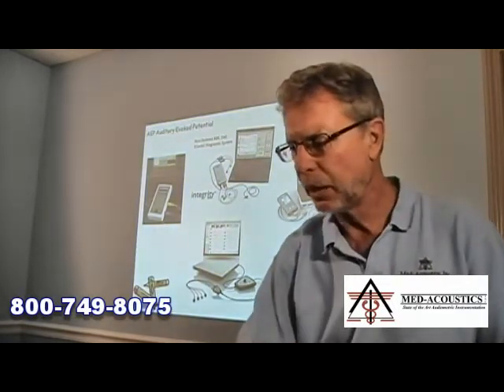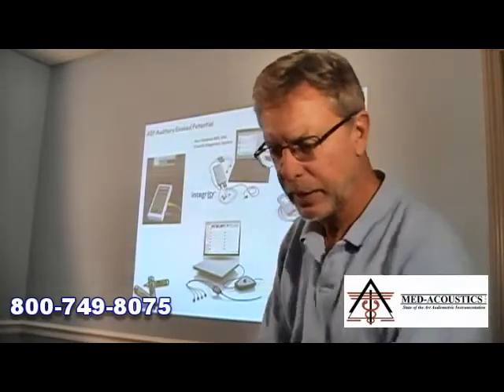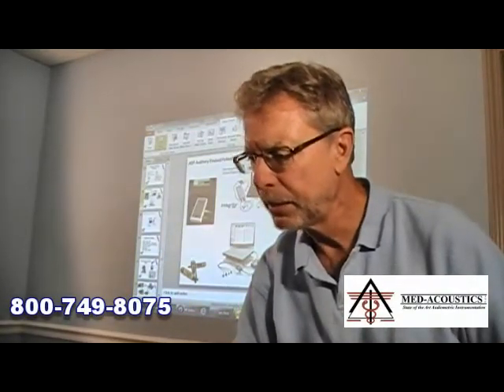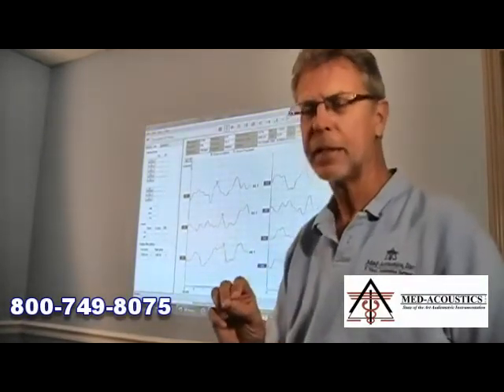Okay. All right. So I'm going to leave this and go to the application of the product. This is the Interacoustics Eclipse. Here's what the main features are. One is very good noise immunity, excellent noise immunity.